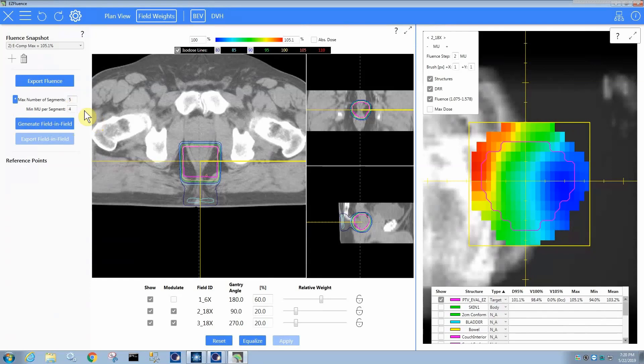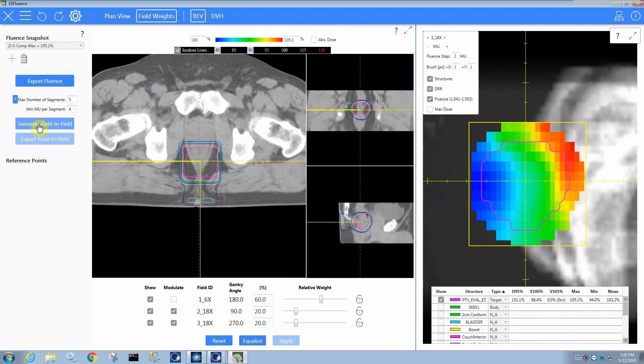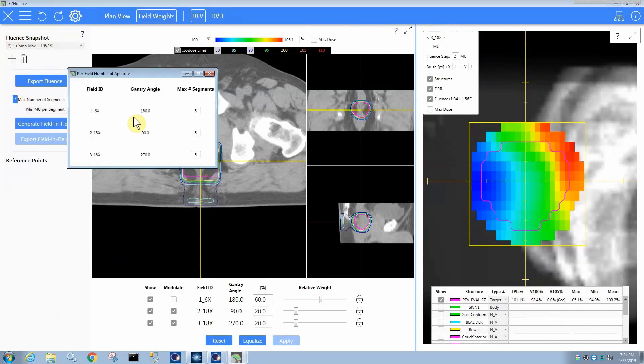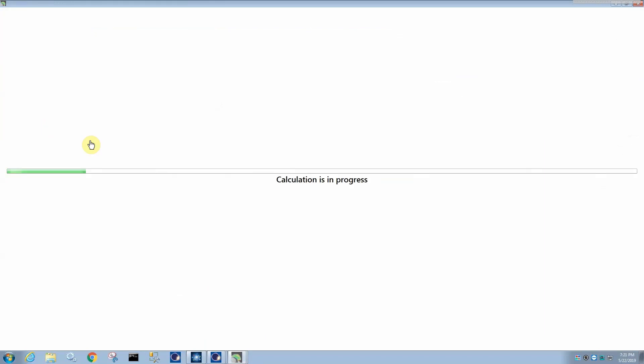So if you like what is produced here, because currently it's an e-comp as you can see in the fluence snapshot, then you can then generate the field-in-field. You can also use the star button to tell how many segments you want per field. Obviously this field is an open field. That's only going to have one anyway, but the max number of segments only gives you the limit, not the actual end result. It will only use as many subfields as it thinks is necessary. So I'm going to generate a field-in-field.